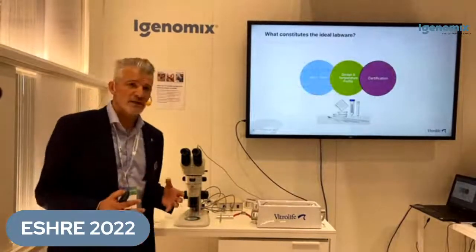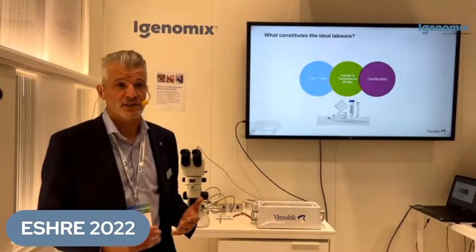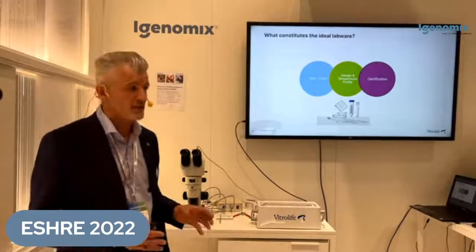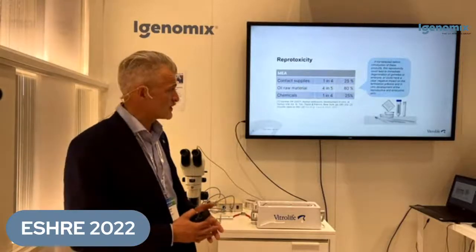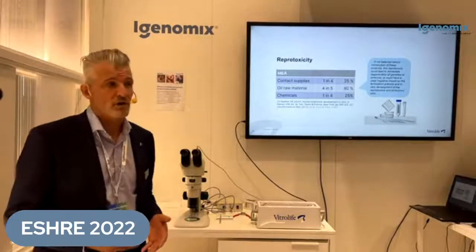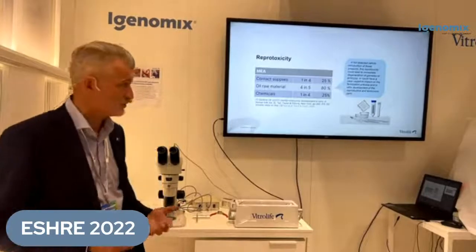I like to break down the importance of plastics into three components. We have to have low toxicity, we have to have a nice unique design and temperature profile, and we have to have the appropriate certification on those plastics. Each of these components has equal importance in getting that right in your system. In David Gardner's former lab at the Colorado Center for Reproductive Medicine, they tested all of the supplies that entered the lab using a mouse embryo assay, and they detected that 1 in 4 of the contact materials entering the laboratory were potentially reprotoxic, and this equates to roughly 25% of all plastics and consumables used.